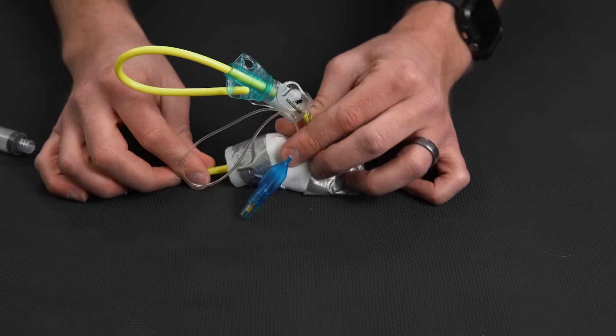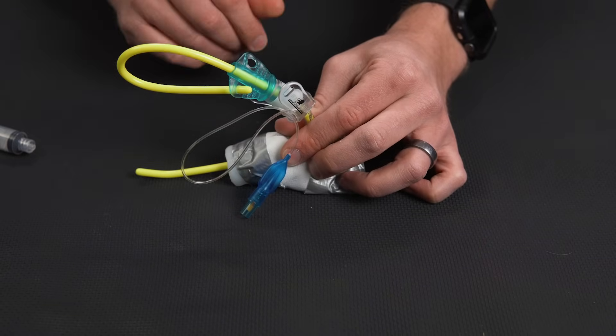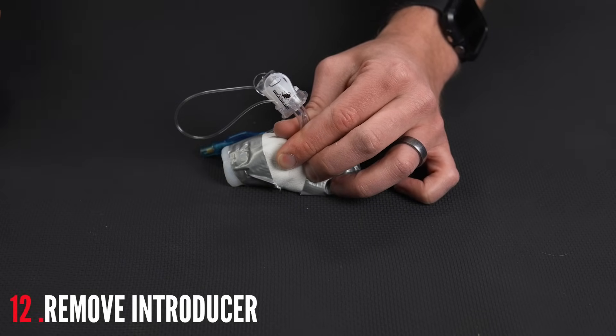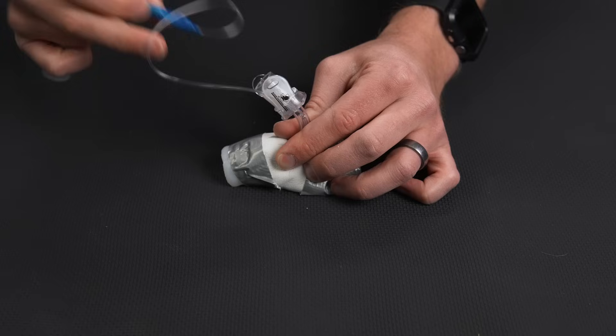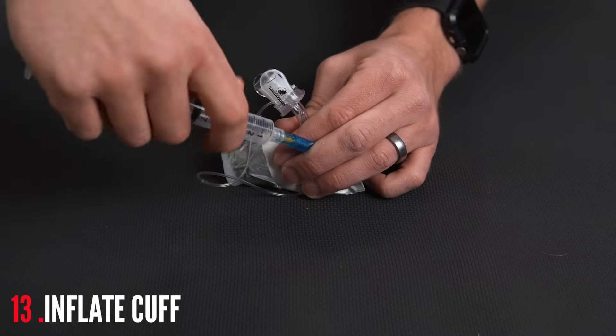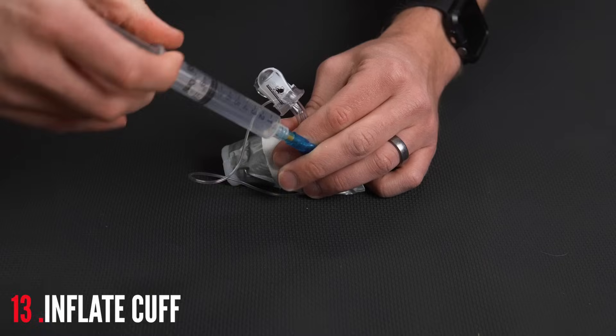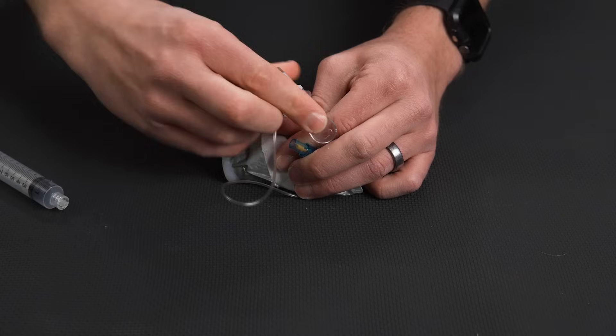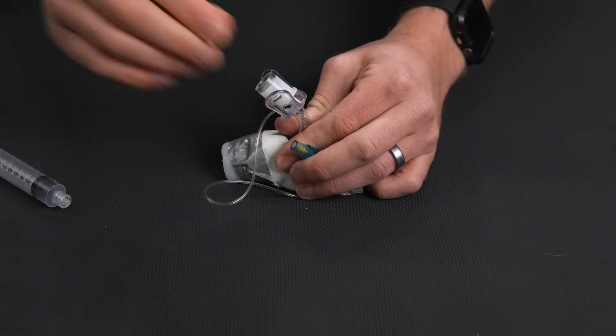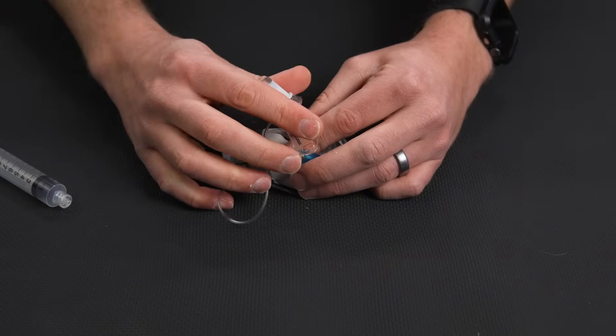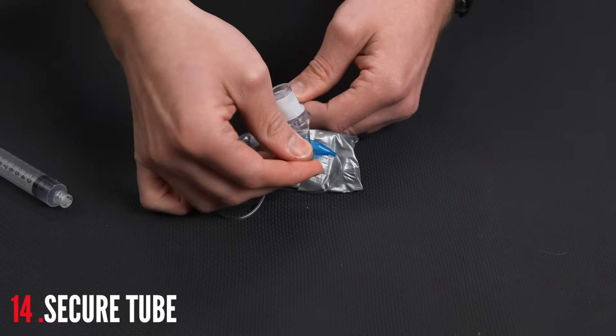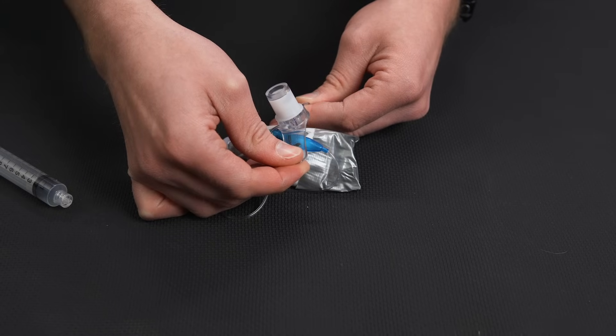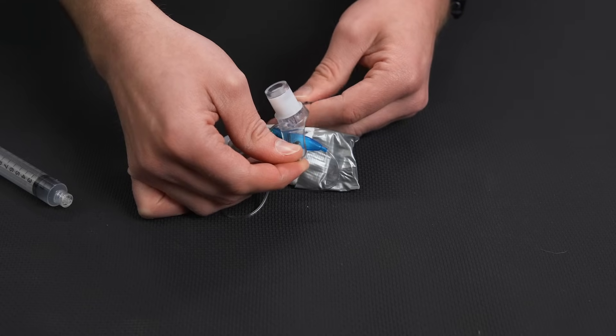I'm then going to take the tube and feed that over it. When you get to this opening itself, you're going to have to twist it a little bit because it might get hung up. And we only want to insert the tube just until the balloon is no longer visible. Once we're in this position, we're going to hang onto that tube. We do not want to let that tube go at all because we don't want to lose the airway. We're going to remove the bougie.